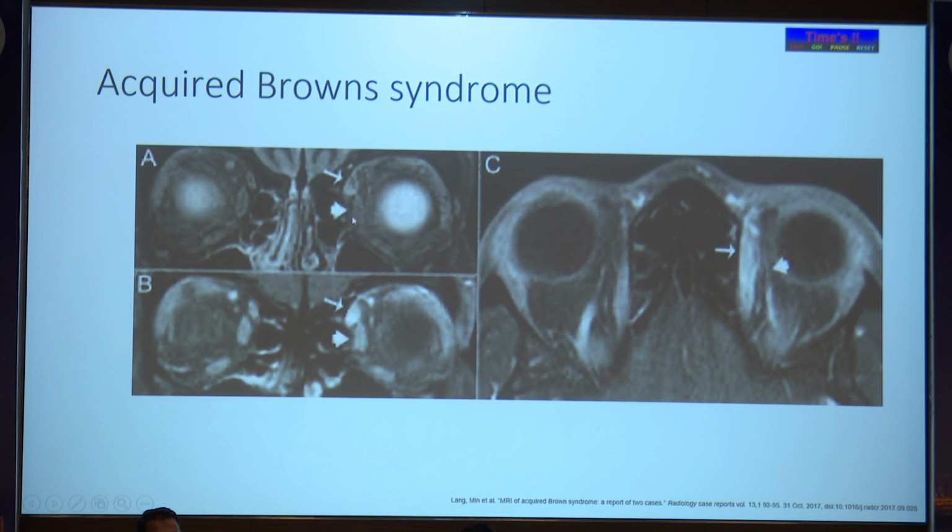Similarly, this is a case of NSOID, non-specific orbital inflammatory disease. You can see there is an intense inflammation in the orbit.